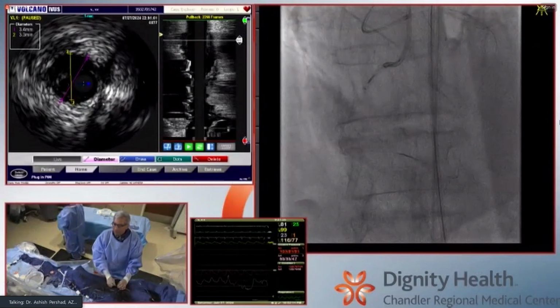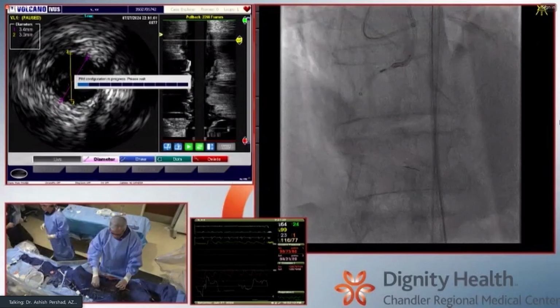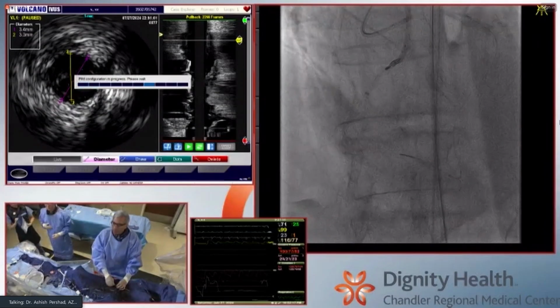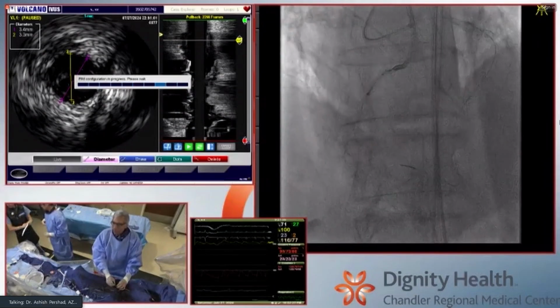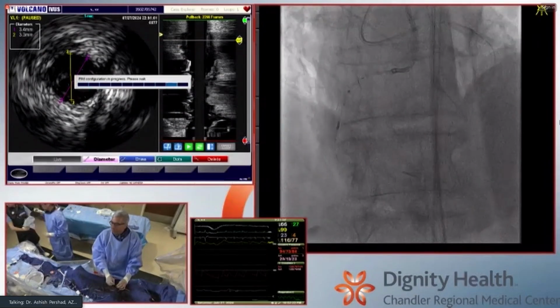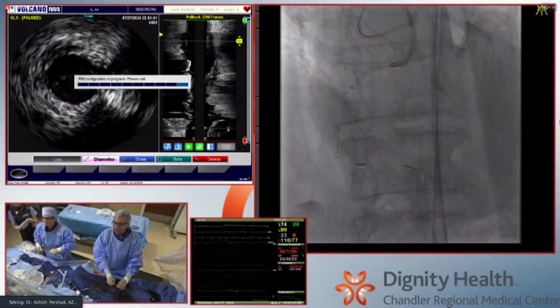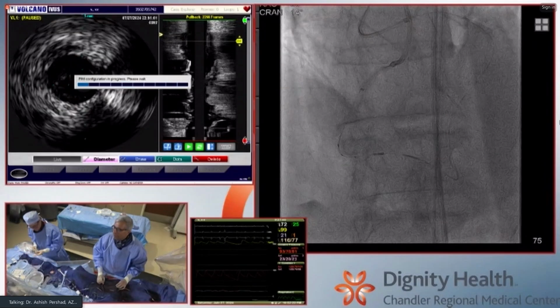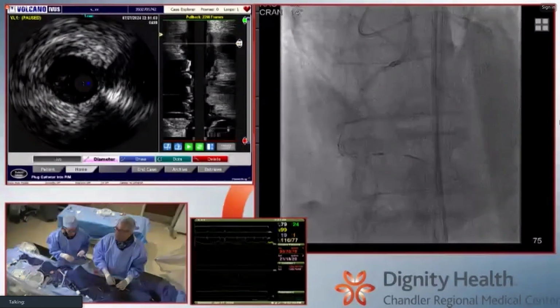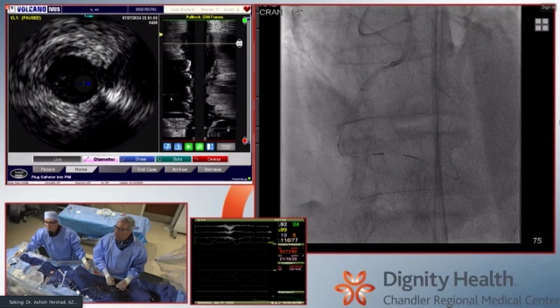One second. We're just having some issues with our PIM, as usual. David, are you able to show the images or not? If impossible, it's okay. He's got some configuration issues right now with the PIM, but we're working on it. Okay, come back. It's okay. You know what? Let's do a rerun. Can I hit a rerun? Yeah, let's run it again.